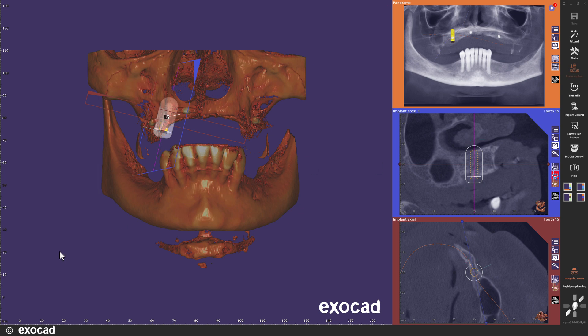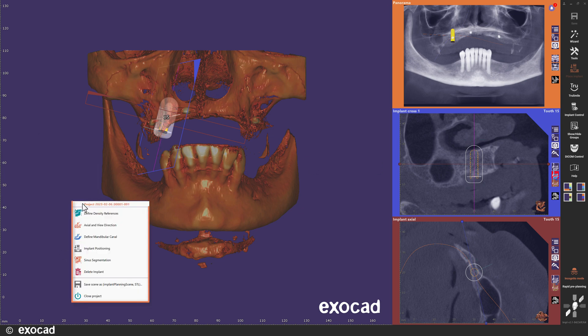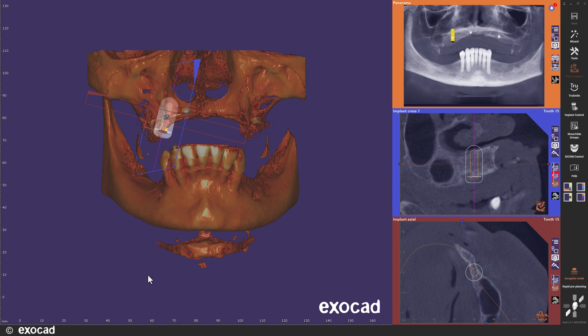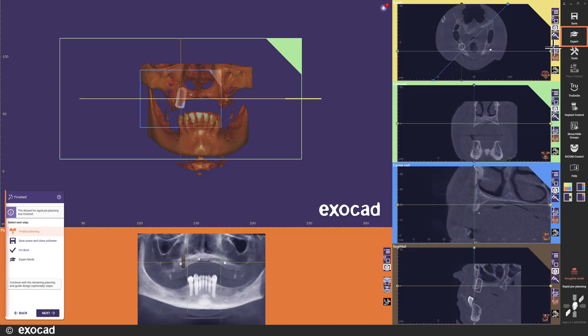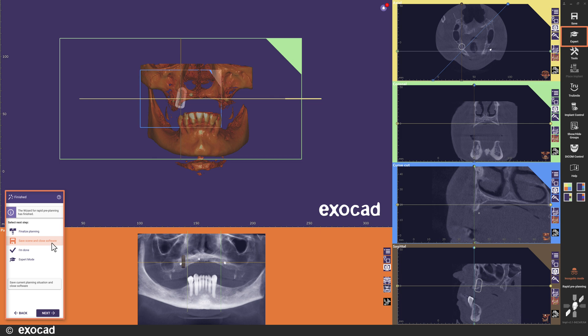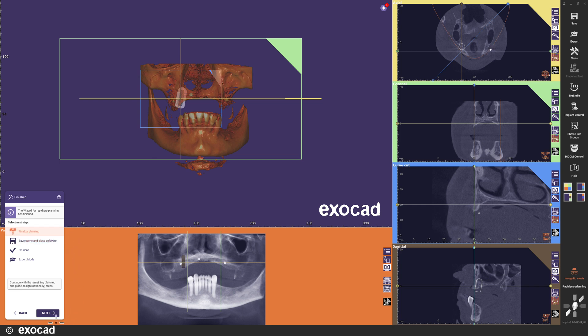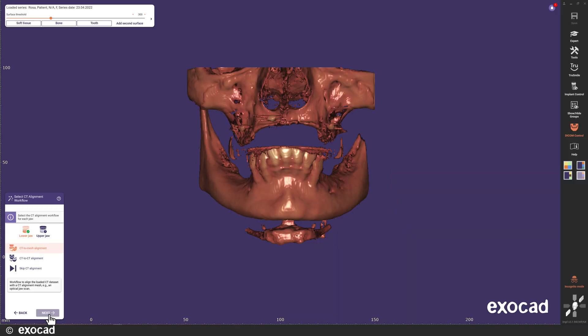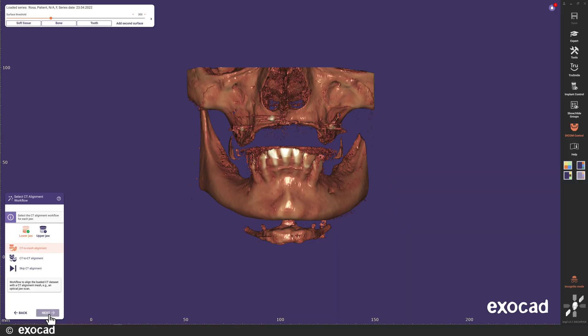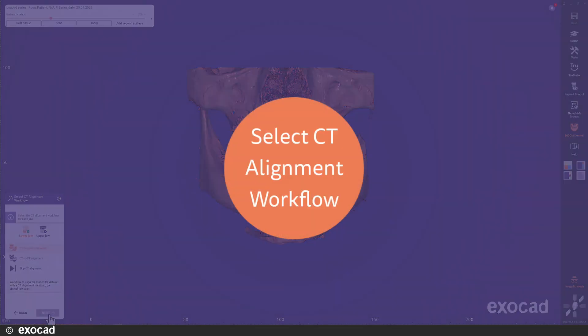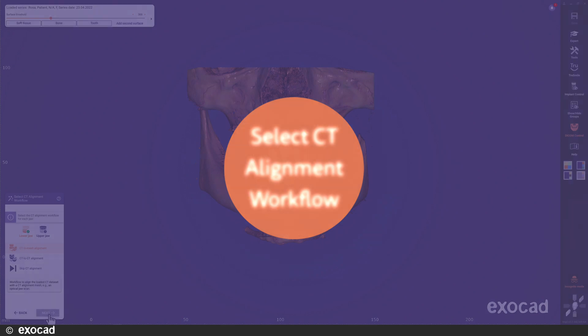When I click the right mouse button, the context menu shows some additional steps that are available when working in the Rapid Preplanning mode. When you are finished in the Rapid Preplanning mode, you can start the wizard and select your next step. If you select to save a scene, you can open the scene in the Normal Planning mode to finish the implant planning whenever you want. In this video, I will continue to finalize the planning directly. When you select this option, the wizard opens in the next workflow step needed to finish the implant plan.